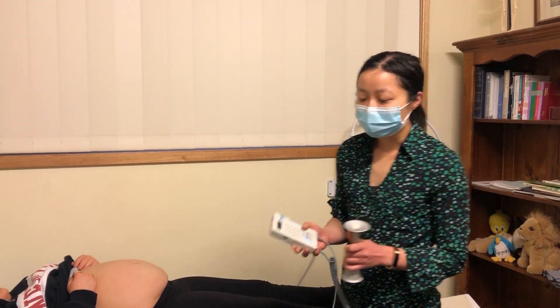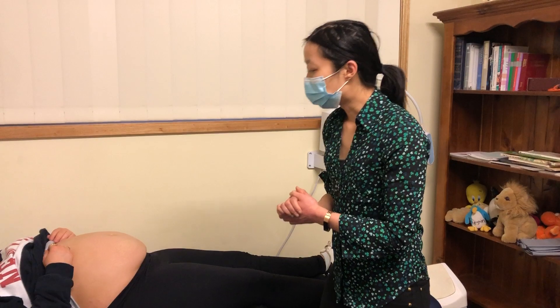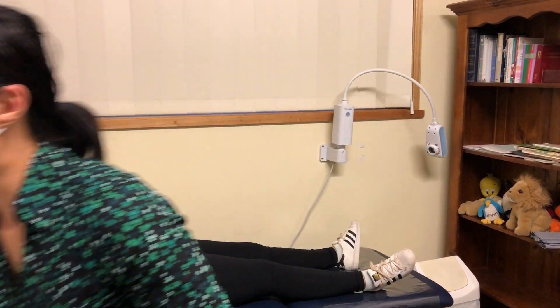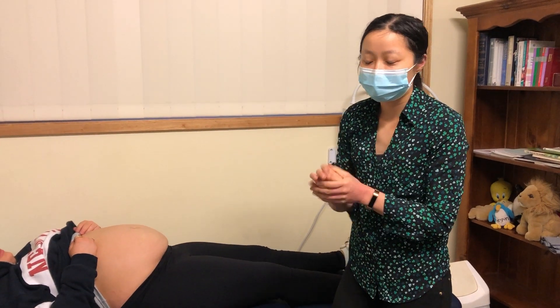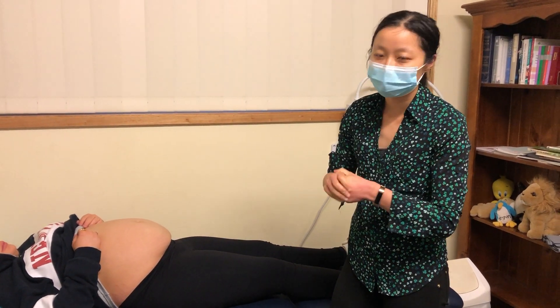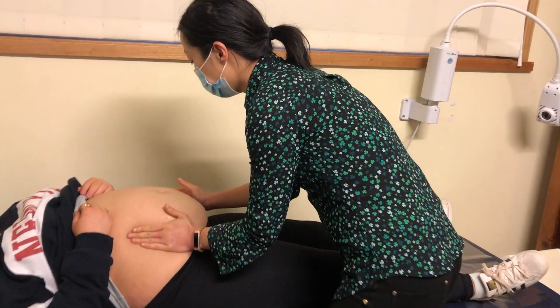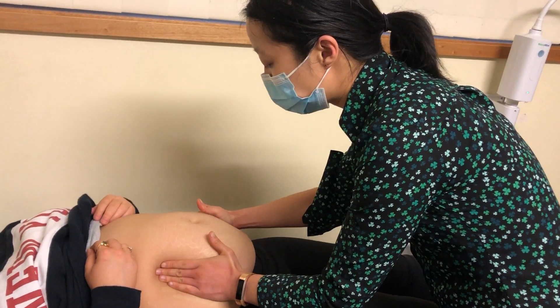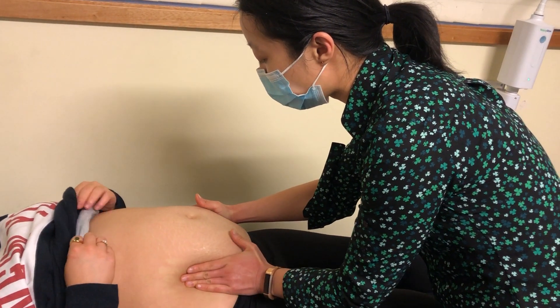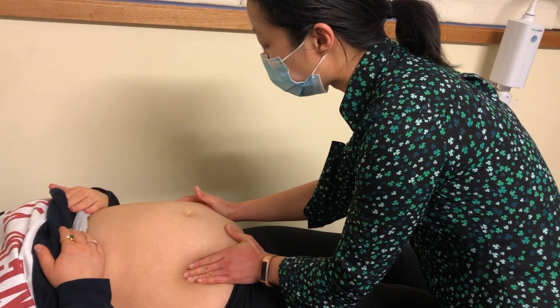To use these devices you need to first examine the woman. When examining her, you need to try and identify where the fetal back is and try to identify one of the anterior shoulders. So we're going to have a feel of your belly, identifying whether there is a particular ridge on one side of the abdomen that would be consistent with the fetal shoulder.